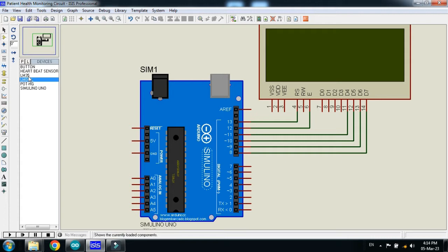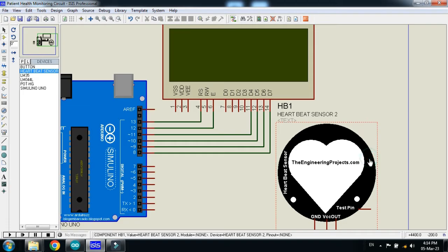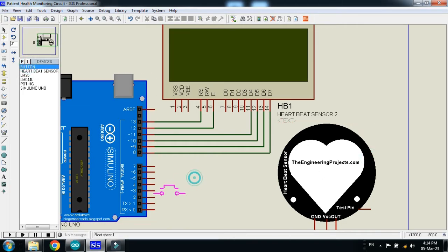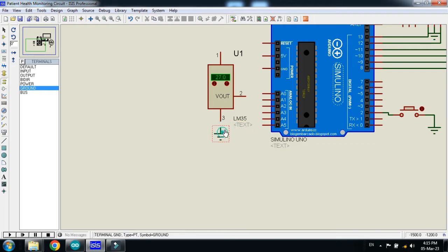Place the temperature sensor, now the heartbeat sensor, now the push button. Connect the grounds where required. Connect the push button to pin 2 and also ground it. Connect the LM35 temperature sensor as well.